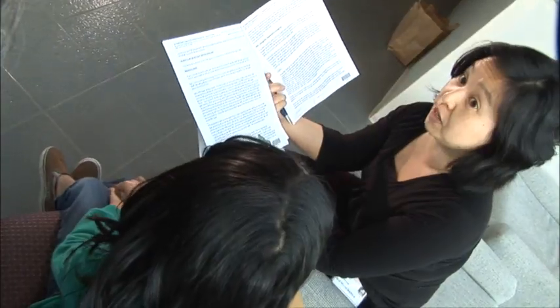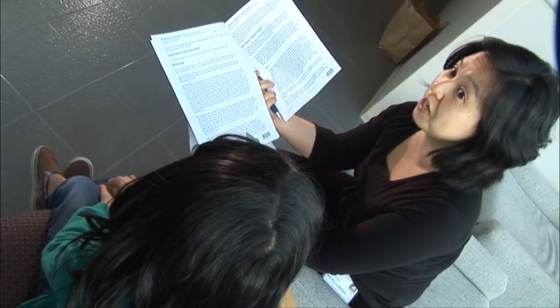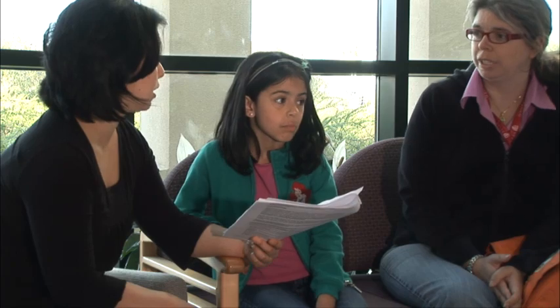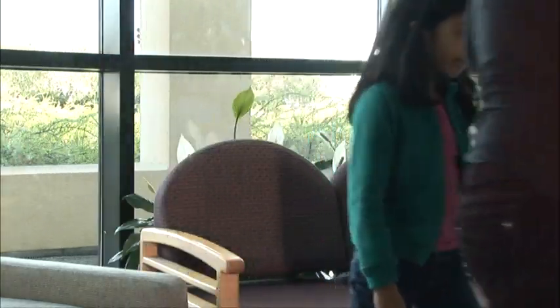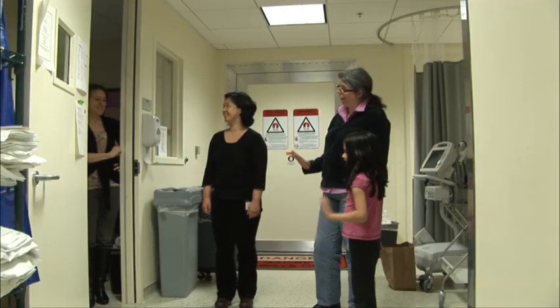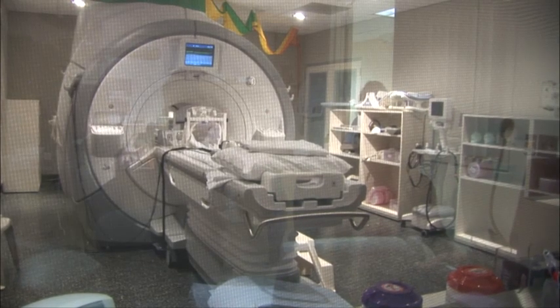There are several forms that your caregiver and you need to sign. The consent forms show that you understand what you're going to be doing. The researchers will explain that you don't have to do anything you don't want to do, and that you can stop at any time. We will introduce you to the other researchers. They work in the console room and operate the MRI scanner. They can watch you through the big window, always making sure you are okay.